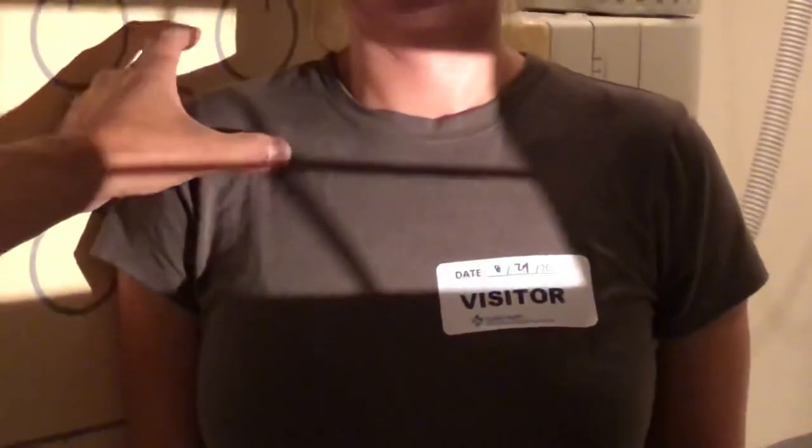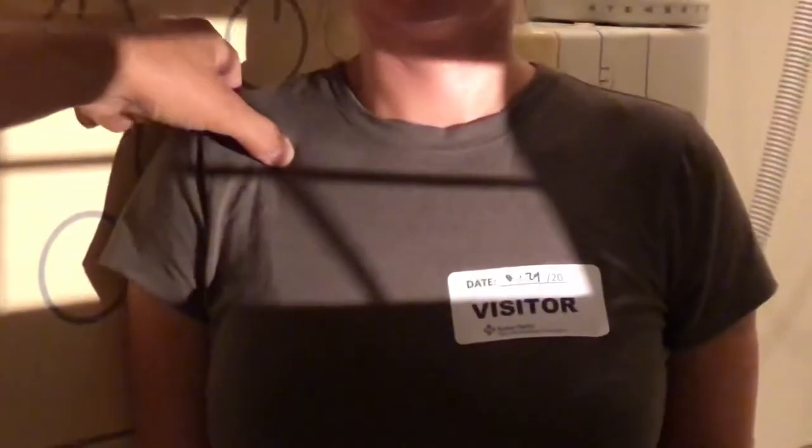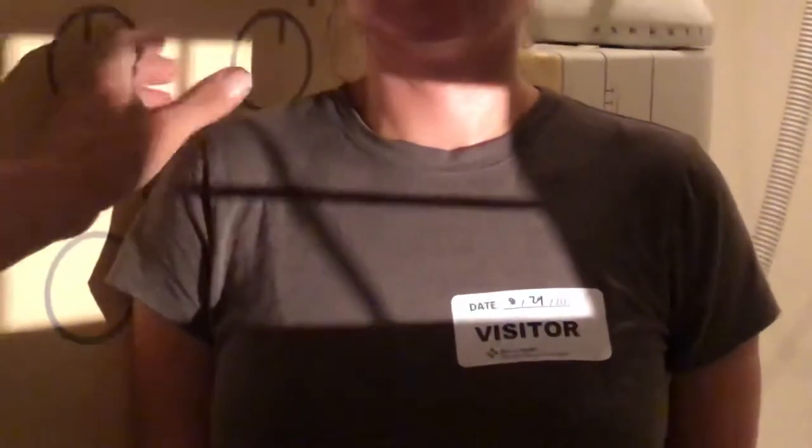So if you can take this angle here, there's an indentation here. Don't worry about the back part. As long as you get something like this — which is a 90, it's a 45 and a 45 — you'll be okay. You want the back to be perpendicular to the board, and we center about right there, external rotation, and shoot the x-ray.